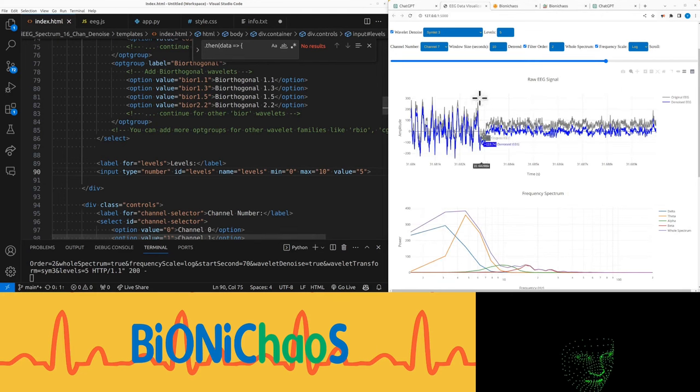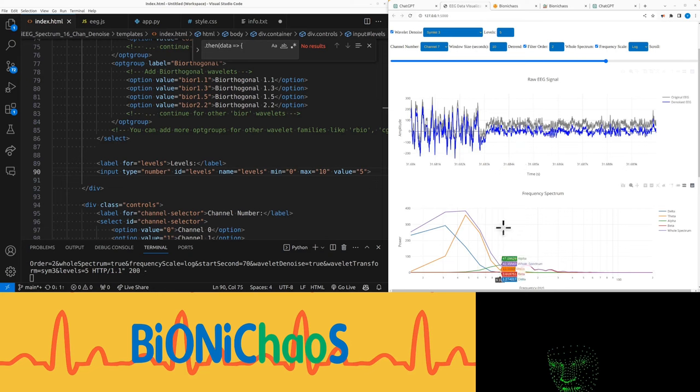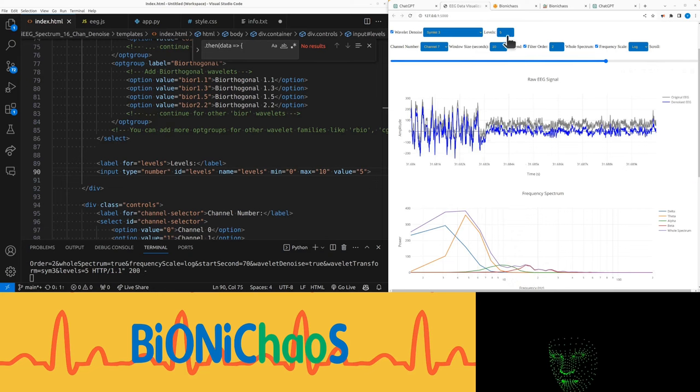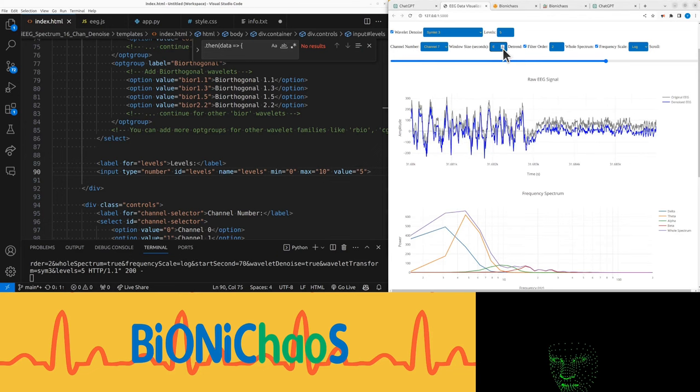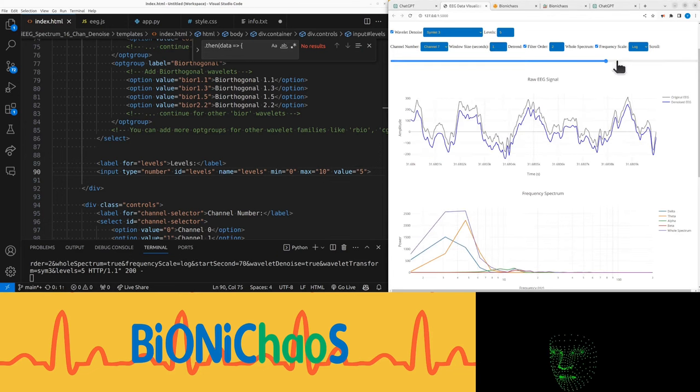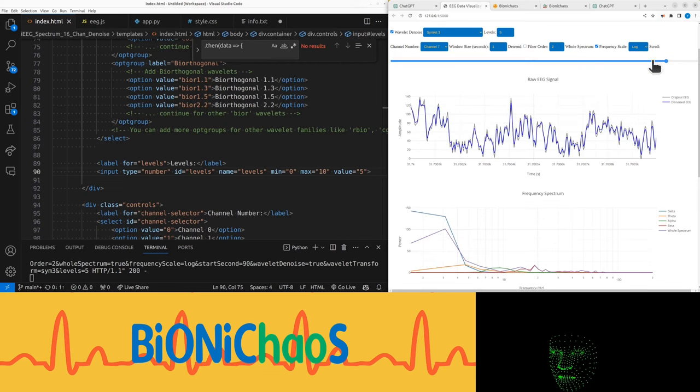So this can be a bit misleading in the sense that you can only see the denoising working well when making the window size smaller. And you can actually see the difference, and it's not working well during seizure.